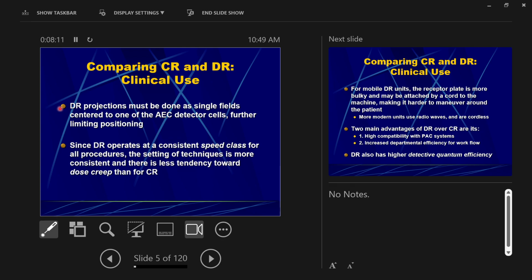Remember, with film radiography, your piece of film was a piece of film, and when you used it for a single image, it was used, right? And every piece of film costs $1 or $2 or $3. So you're saving a couple bucks every time you condense projections onto one piece of film. It was a money-saving technique for offices. That's all it was ever meant to be.